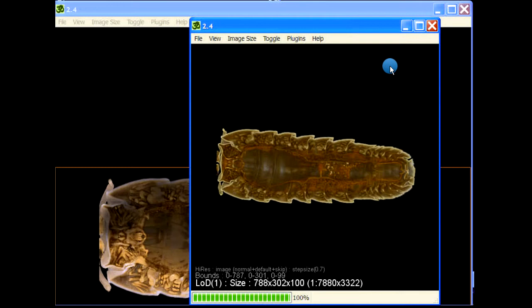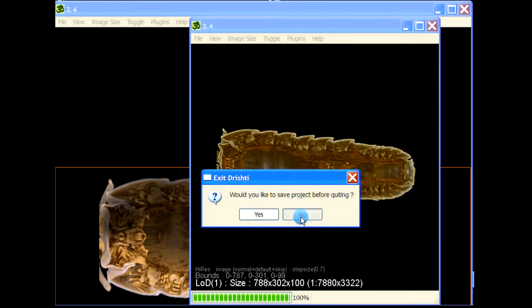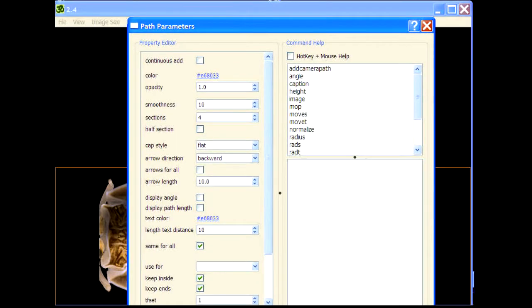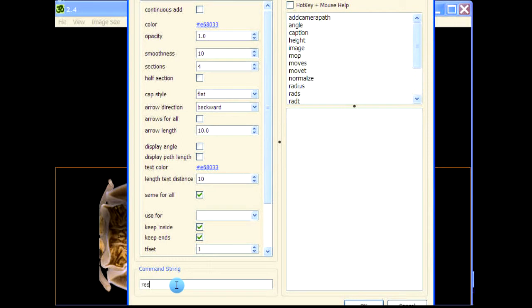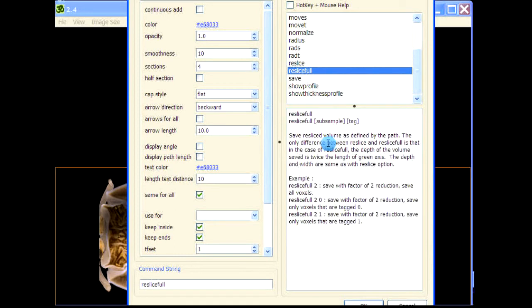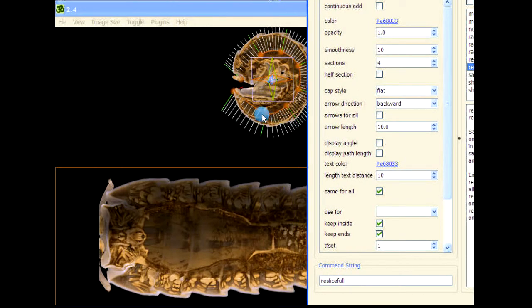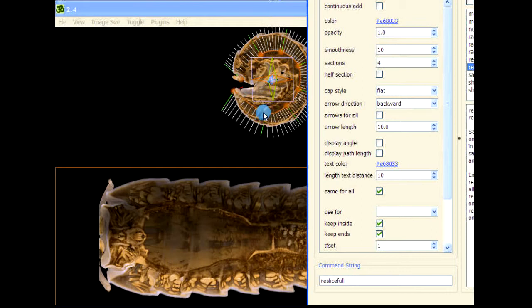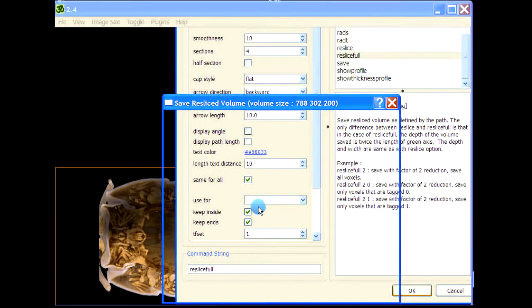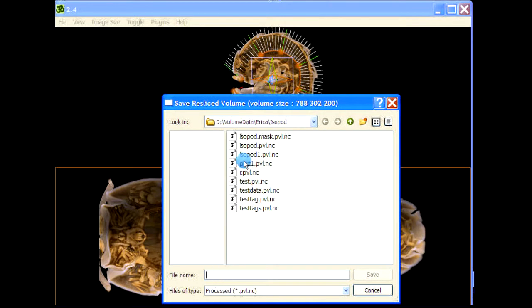Now this is reslice. Let's see what happens when we do reslice full. Reslice full is very similar to reslice except that now you'll get twice the depth. Twice the depth is basically twice the green axis, so twice the length of the green axis. When we do reslice, the data will be saved in the depth axis from the center of the spine to the end of this green axis. When we give reslice full, then the data is saved from this point here reflected on the other side of the spine, so from here to here. It's basically twice the length of the green axis. Let's do reslice full and then part two.